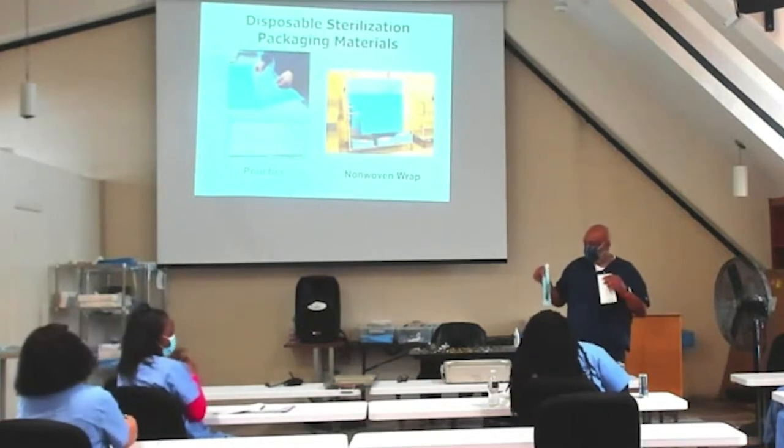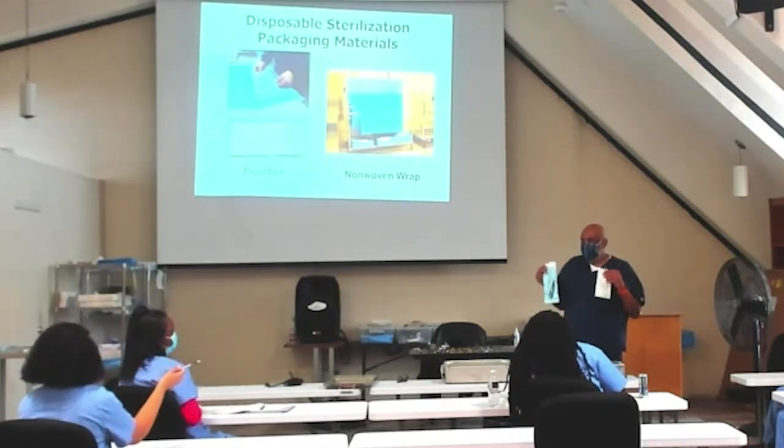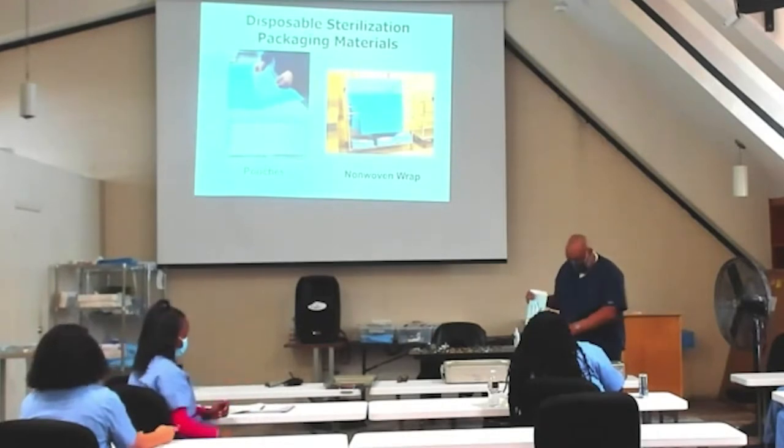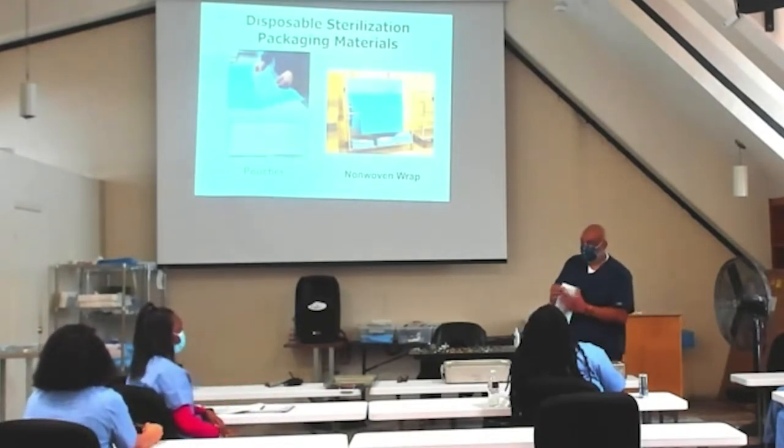I'm assembling this tray. Which one can I use? The bag. Why not this? Poke holes. I can put an indicator in here. Why can't I use this? Hello, moisture. That is the reason why. Other than that, that's the only. So if you're assembling a tray, never put these in your tray, sealed or open, because it will maintain moisture.